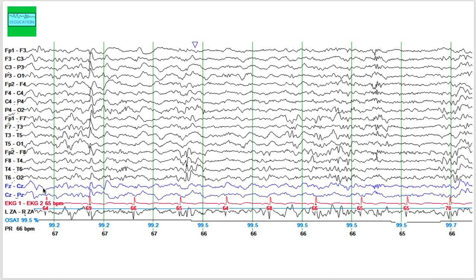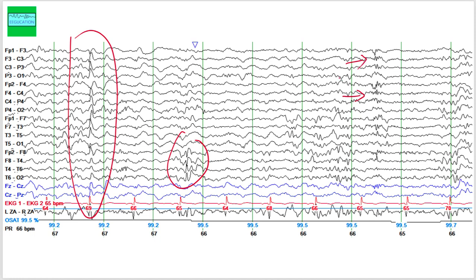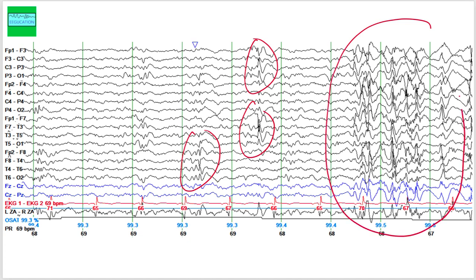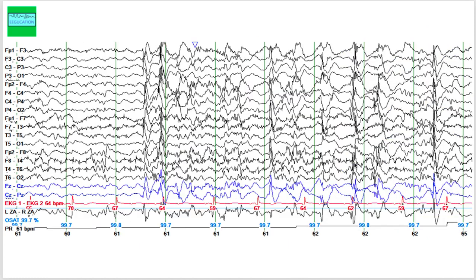More of the same is seen here — your eyes should now be tuned to identifying these sharp waves, the generalized sharp waves, and some fast activity. Apart from the focal sharp waves, you also see bursts of generalized sharp waves with some fast activity, which is also called paroxysmal fast activity. This includes generalized spikes, generalized spike-and-wave, and beta discharges — paroxysmal fast activity intermixed with generalized spikes and generalized poly spike-and-wave discharges.